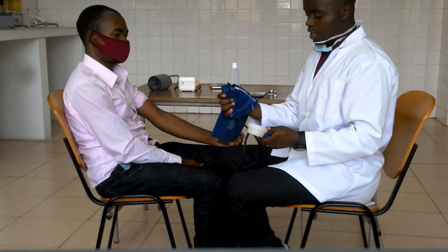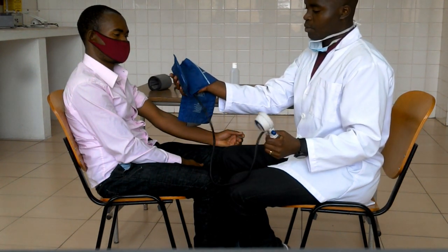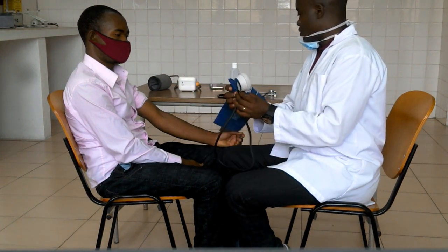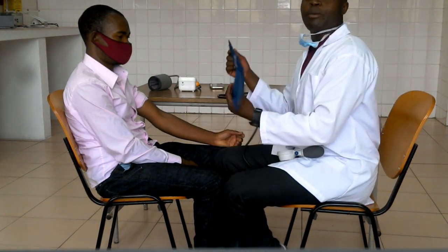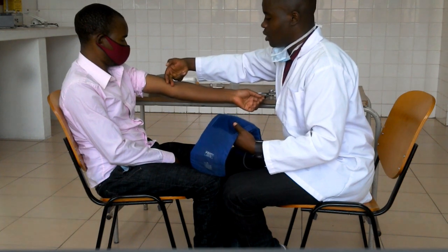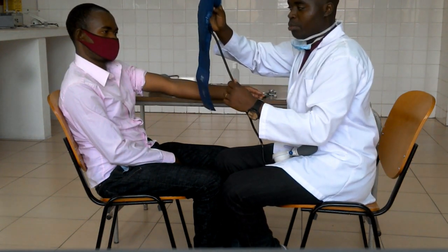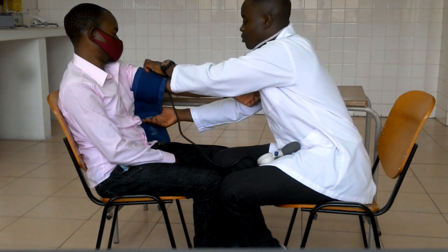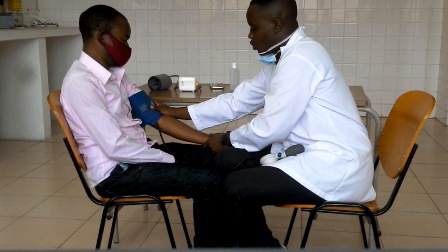The next step is to check if your cuff is working perfectly — pump air and check that air is not coming out. Now it's fine. This cuff is placed around the patient's arm, two inches above the cubital fossa or above the elbow. The two tubes of the cuff must point downward — you wrap it this way.